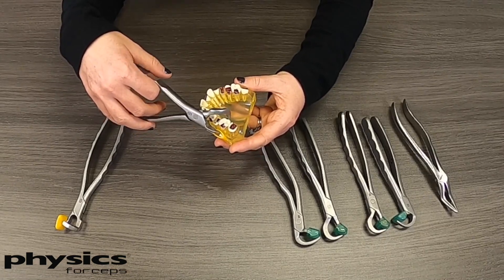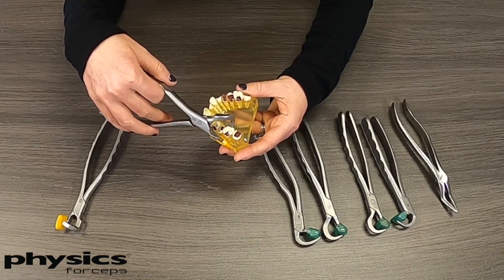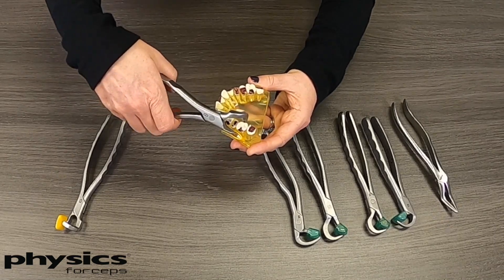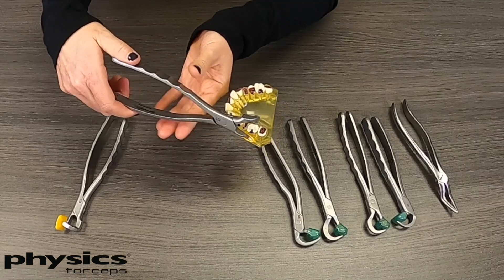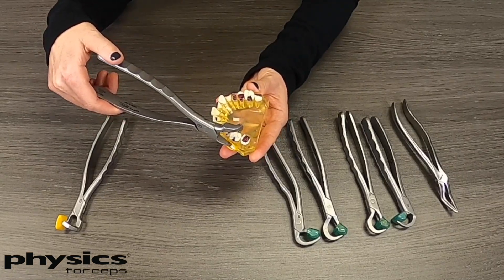It's the same concept as the standard Physics Forceps set: you place the bumper as far down on the vestibule and the beak as far down on the sulcus on the lingual. Not squeezing too hard — you'll want to bring your hands back on the instrument and then slowly rotate out towards the cheek.